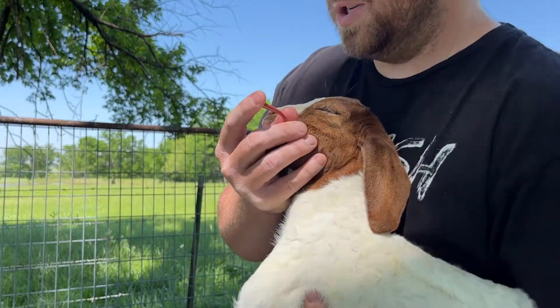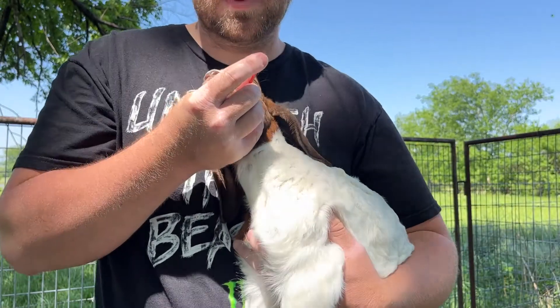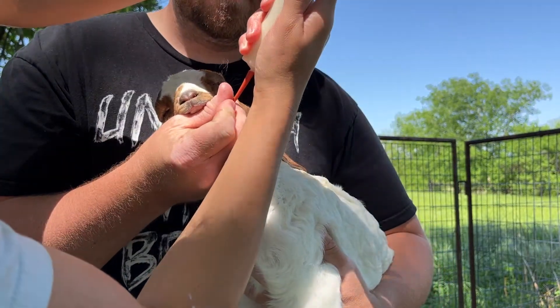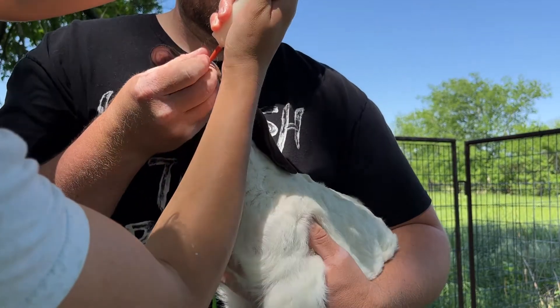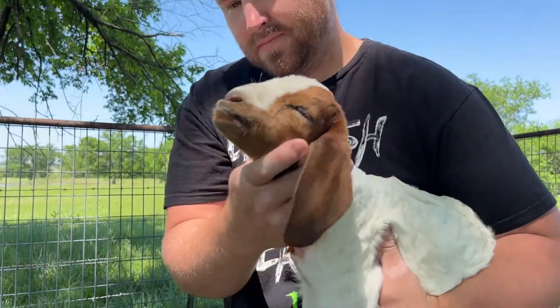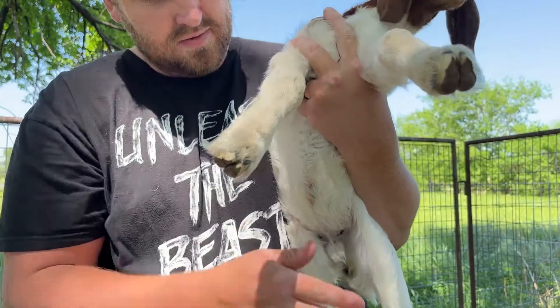It's good to put your finger over it while she's drawing up some more, because sometimes if he pushes or tries to get down, he'll squirt it back out. Then we'll let him down to potty with a full belly.